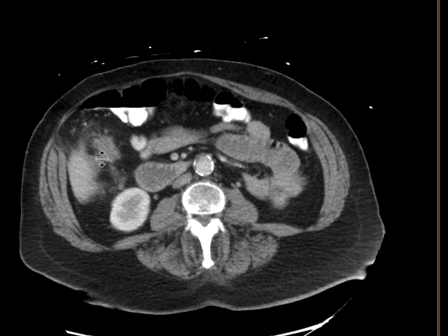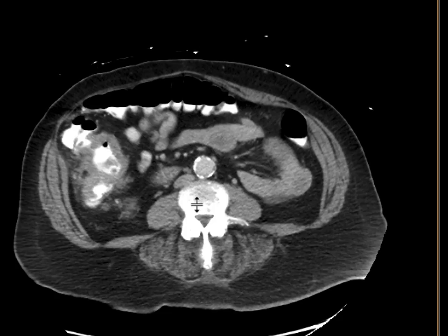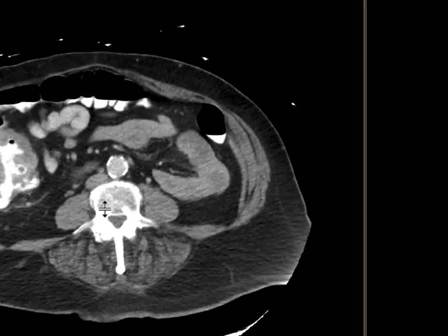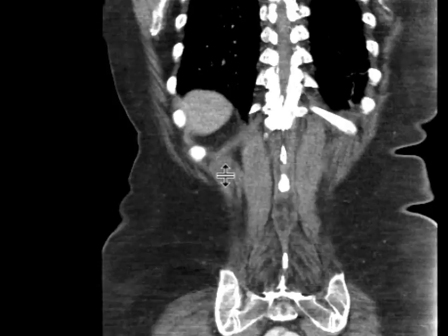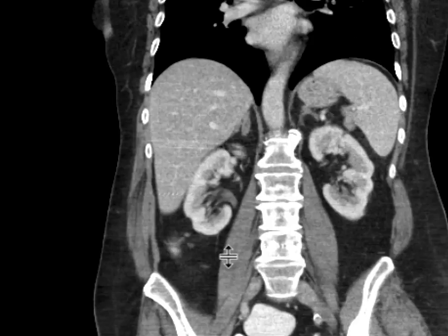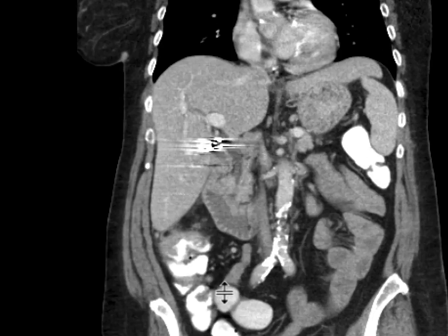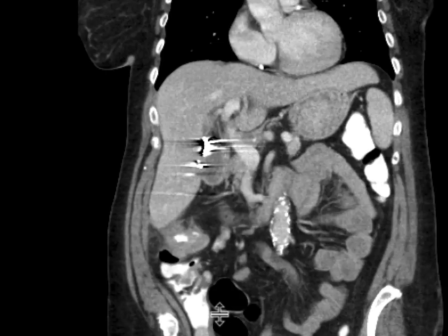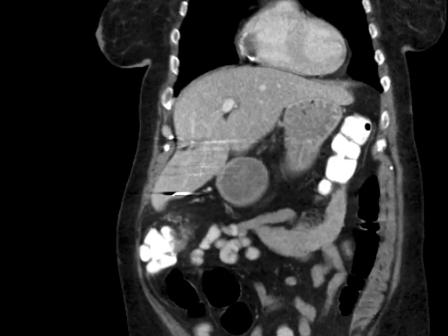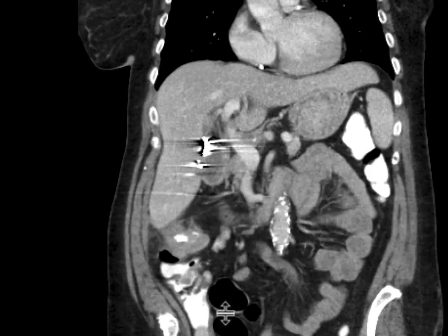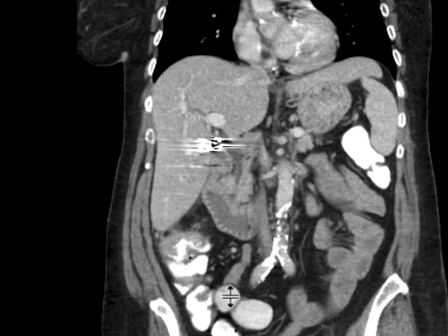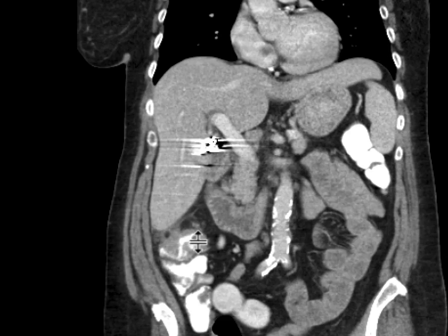You can see surrounding it there's some abnormal soft tissue. Some of this is going to be adenopathy. On the coronal images as well, we can nicely see this segmental mass involving the ascending colon with soft tissue thickening and some adjacent nodes.